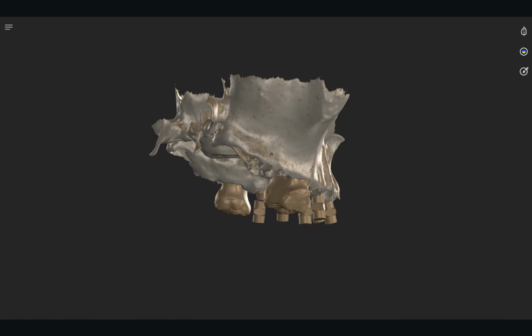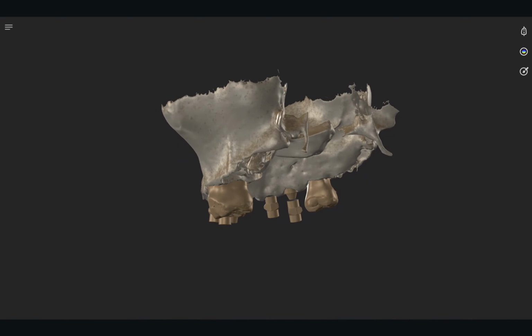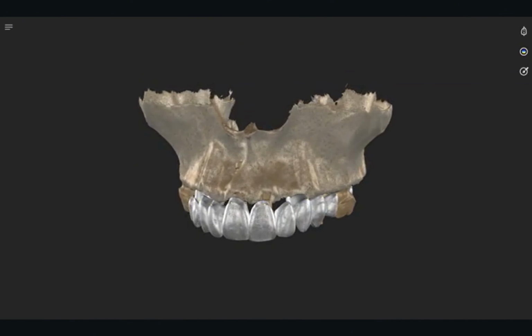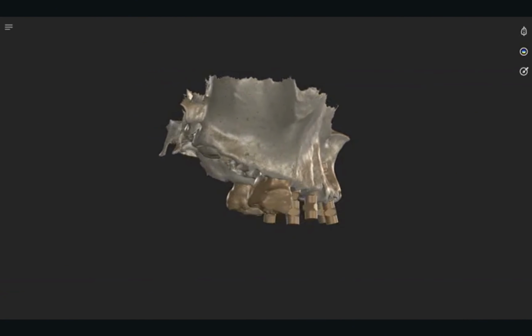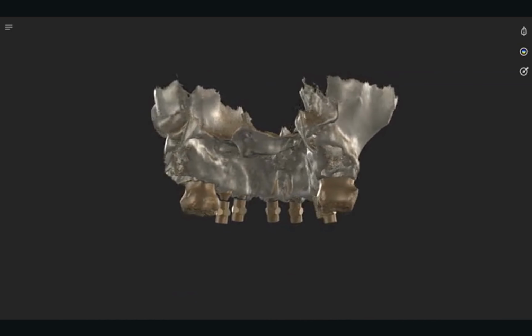It allows for you to integrate 3D planning in situations like FP1s, which have always traditionally been a very challenging case. You have the ability then and there to see prosthetically how that relates to your implant placements.